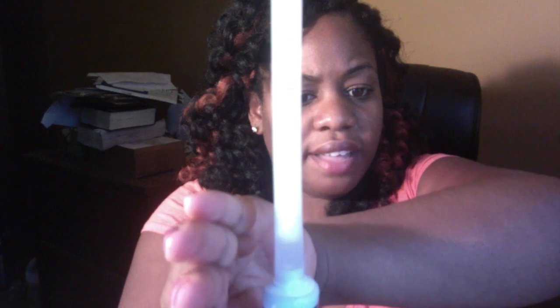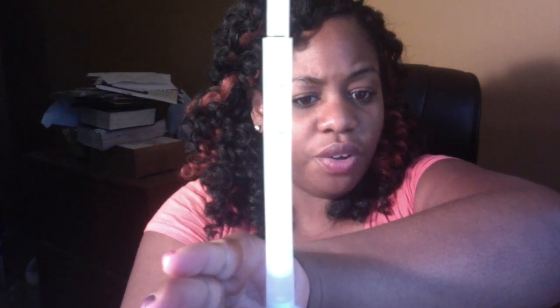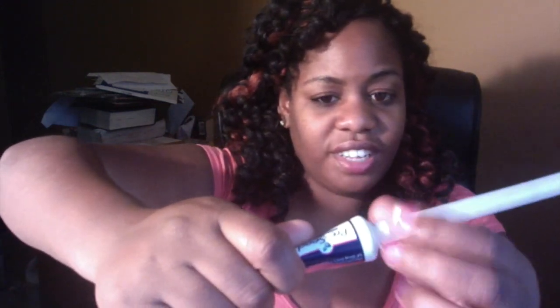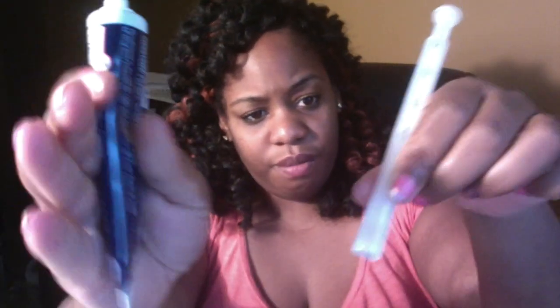And at the bottom, you can see that's about as much of the gel that's in there. You can push it up or down, so it slides back down very easily. So if you push it up to the mark that you need, which is usually what I use, 1 gram, just tilt it and start unscrewing it, keeping it kind of tight because it does screw back down. And so this is the amount that is about 1 gram, if you can see it.